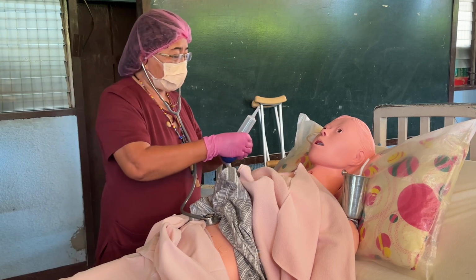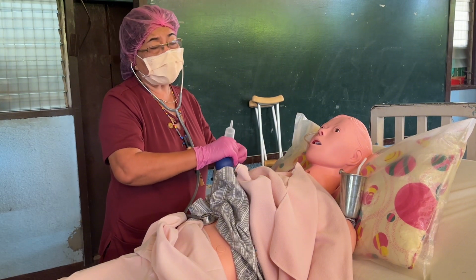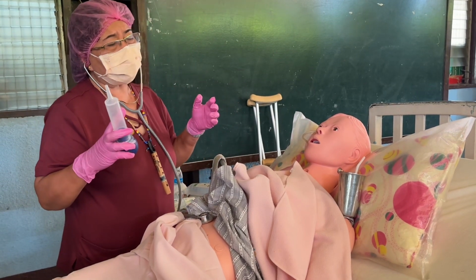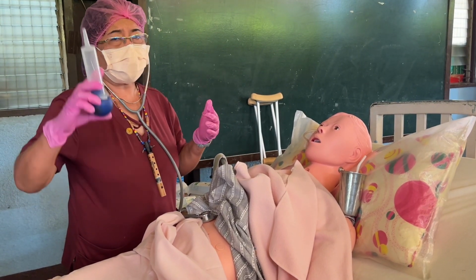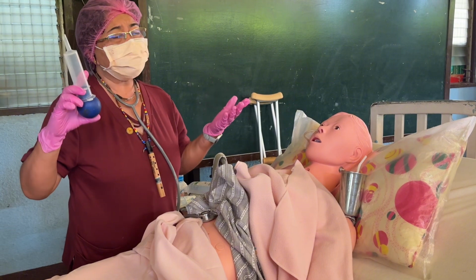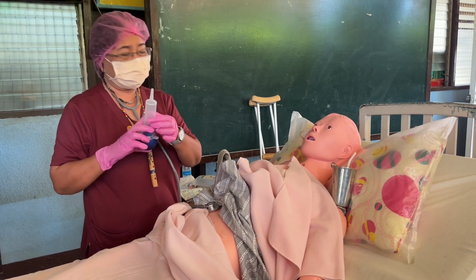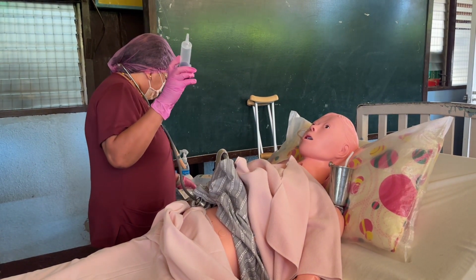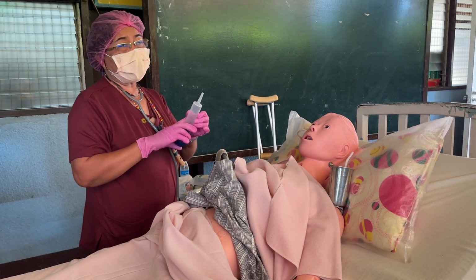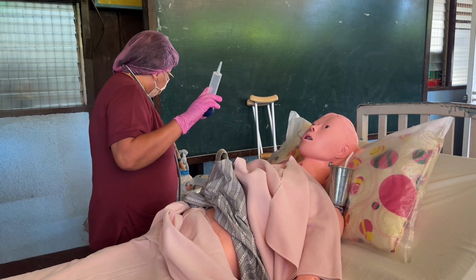you're going to get a glass, medicine glass or any receptacle, in which you will put the litmus paper or pH indicator tape. The pH indicator tape has color. So it will change to blue when you mix it with a base. So if it is gastric juice, if the fluid or liquid comes from the stomach, what do you think is the color? It should be orange, brown, or red. As for the numbering, it's lower, 5, 6, lower than 7, no? It is acidic.